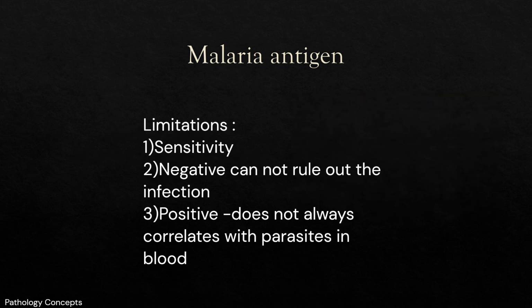The limitations of this RDT are the following. The sensitivity for RDT remains a problem. A negative RDT cannot at present be accepted at face value; it will need to be confirmed by microscopic examination. A positive RDT does not always correlate with presence of parasites in the blood. After the clearance of parasites from blood, it can still show a positive result on RDT.